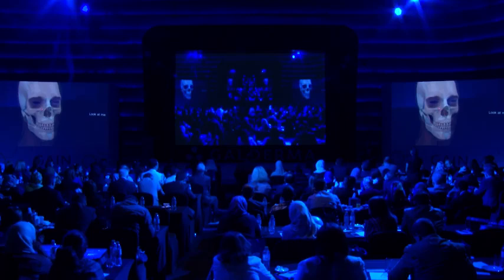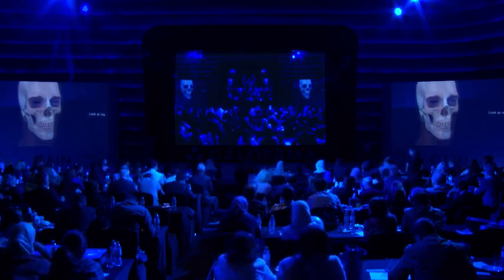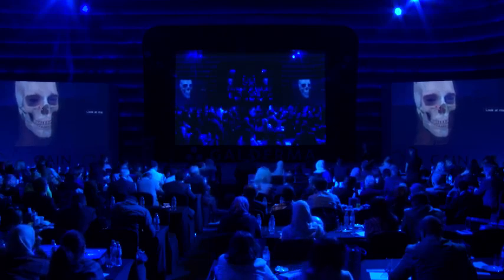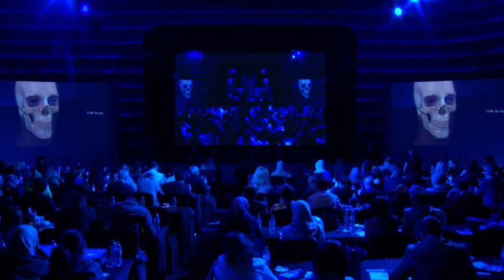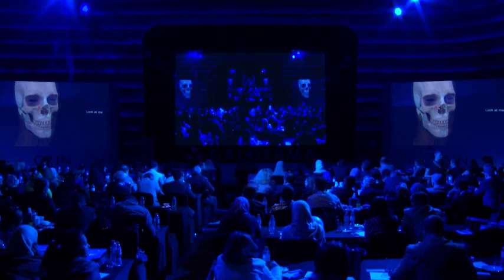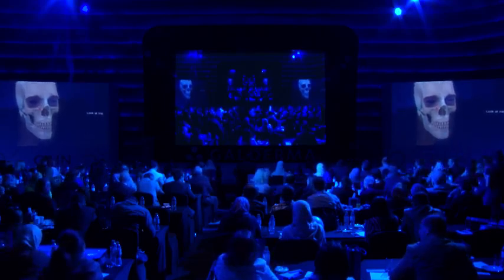According to the tower technique, what is the amount we inject from central to peripheral, or medial to lateral? Do we start with a big amount, then withdraw by a little amount, or the same amount all over the zygomatic arch? I'm sorry, did you get that one? No, I didn't. Could you repeat the question? What is the amount? How can you inject in the zygomatic arch in the tower technique?